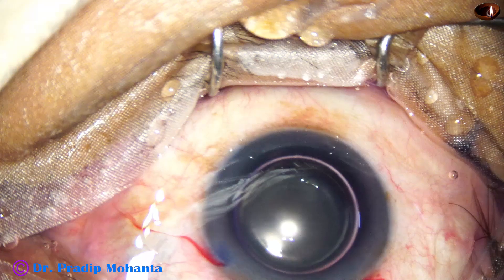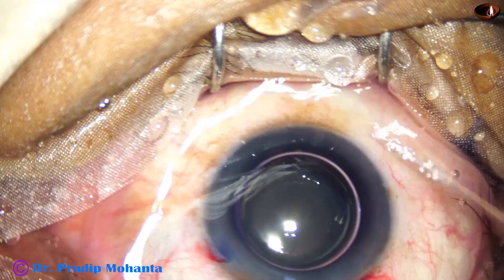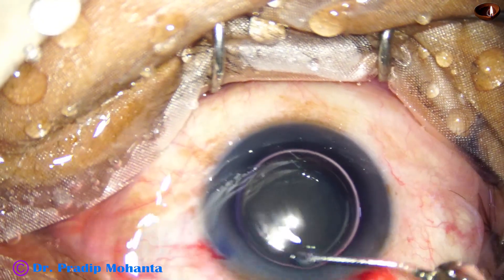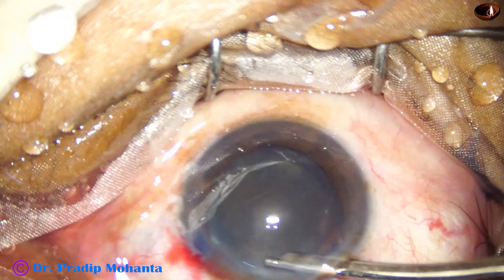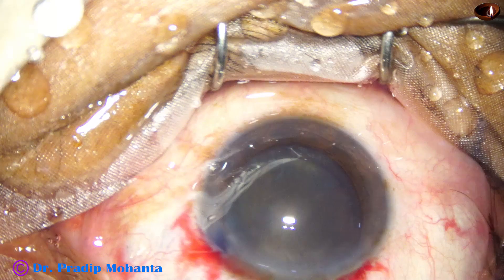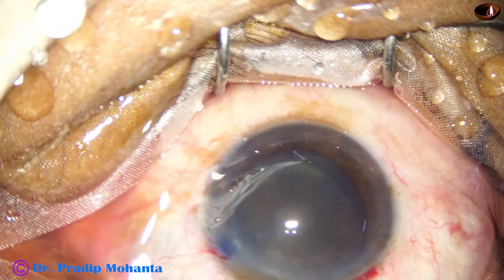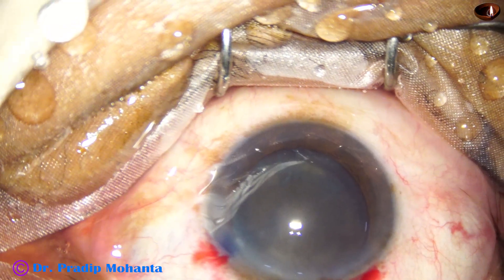There is less concentration of dye in another part of the anterior segment, and this causes some problem in visibility. So it is always better to wash excess dye out of the anterior chamber. I use a 23G simco cannula to wash the dye out — you can just irrigate the anterior chamber with BSS or Ringer's lactate and excess dye will come out.